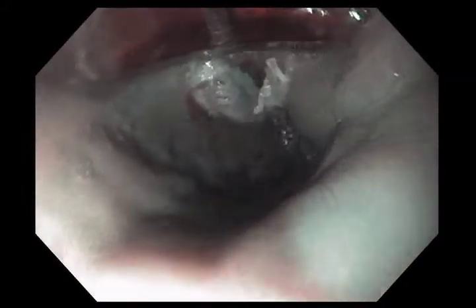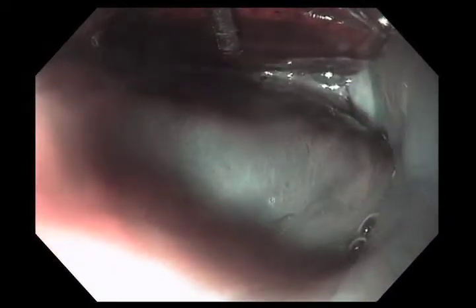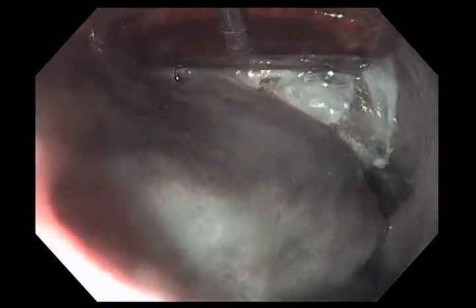There you see the white eschar — sort of like searing tuna — that's produced by the radiofrequency energy. I just position the baseball cap, or the radiofrequency ablation device, against the tissue, hit the pedal, and it produces this very superficial burn. You can see the white scar tissue there.